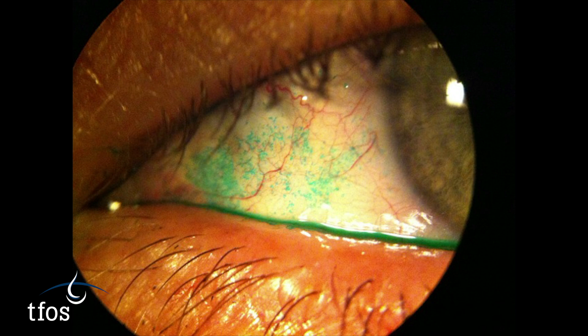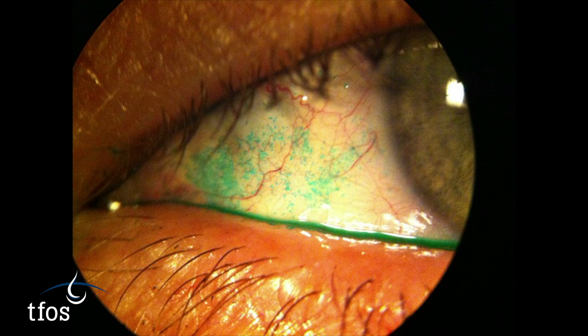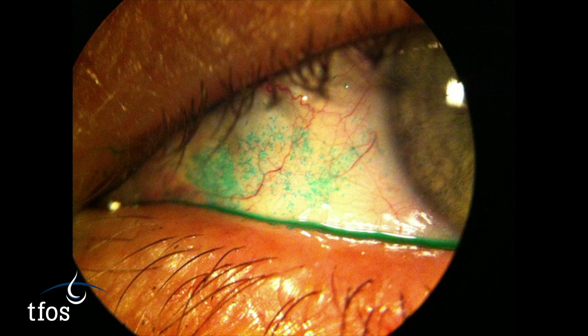A positive score for diagnosis of dry eye is greater than nine conjunctival punctate spots. Again, validated grading systems can be used to monitor changes in the severity of staining over time.